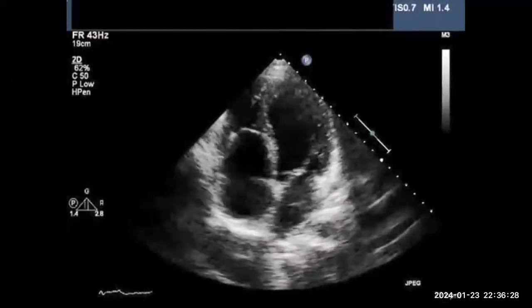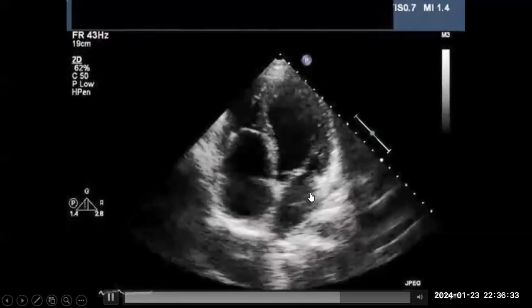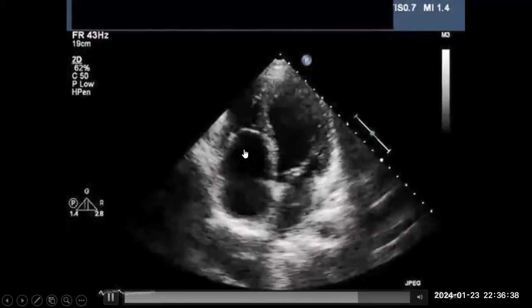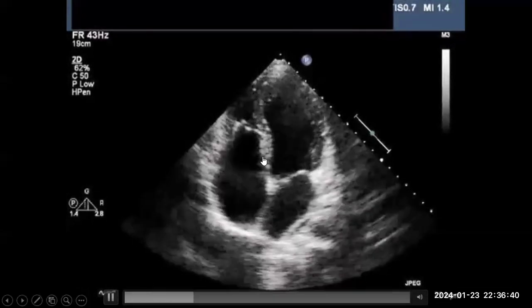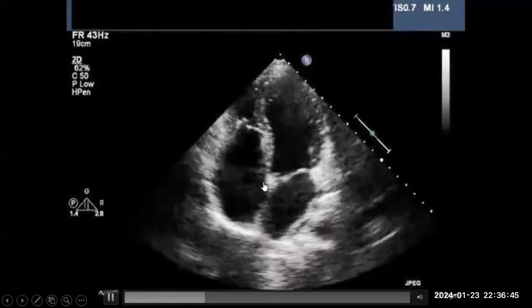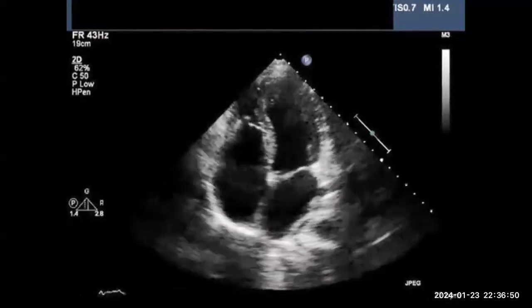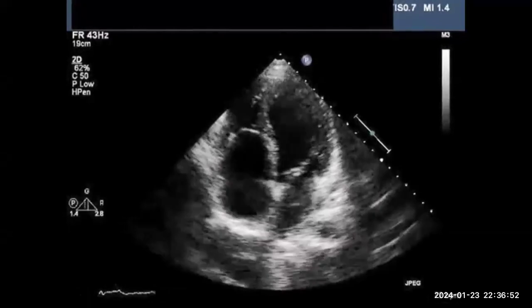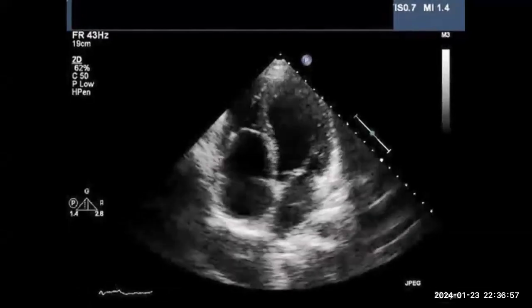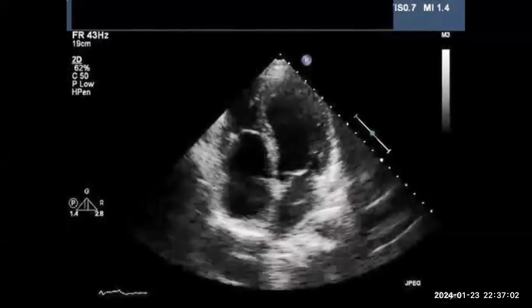This is Ebstein. Okay, clear? So here it's very clear, in comparison with the previous one, you see how big the gap is between the left-sided and the right-sided valves. So the mitral is here, while the anterior leaflet of the tricuspid is significantly displaced. How much does it need to be to fit the criteria of Ebstein? The apical displacement of the... More than 8 millimeters. Yes, it's indexed. Am I right? Yes. So 8 millimeters per square meter.